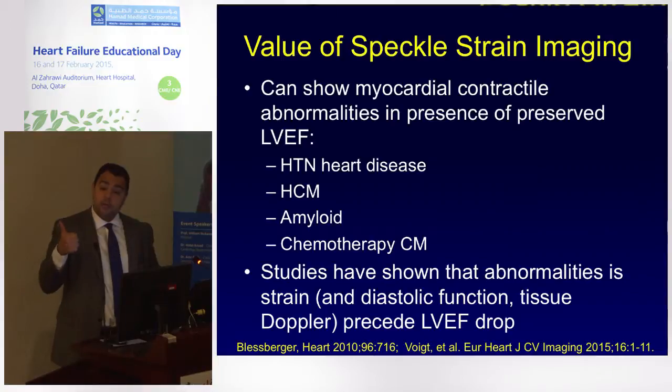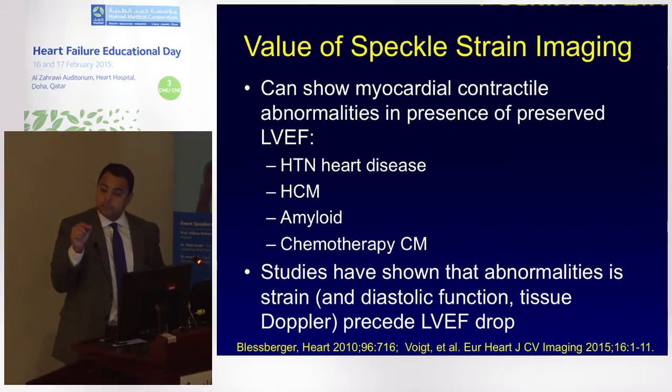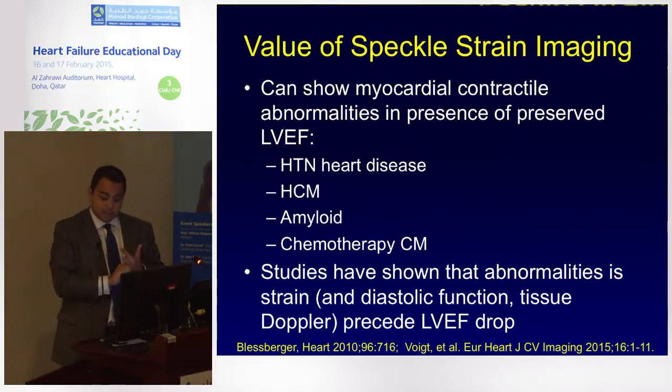Remember I told you his longitudinal, circumferential, and area strain were all depressed. His systolic strains were all depressed. His severe LVH. So we have very good measures of left ventricular systolic dysfunction in this gentleman with his severely hypertrophied ventricle, even though he has a preserved ejection fraction. And there's a large body of literature showing that tissue Doppler imaging in systole and systolic strain imaging can show regional and global systolic abnormalities in patients with cardiac disease but a preserved ejection fraction.